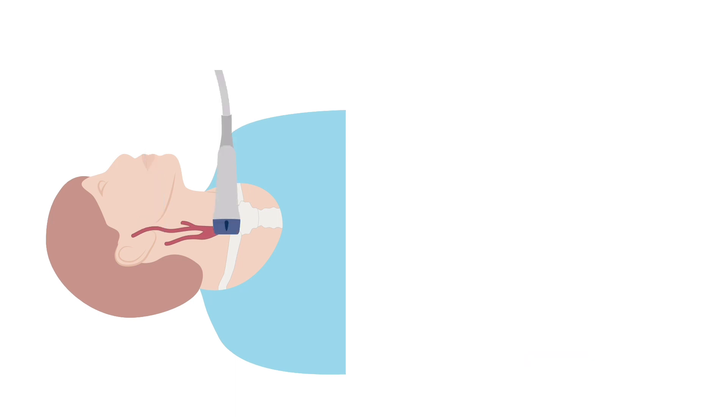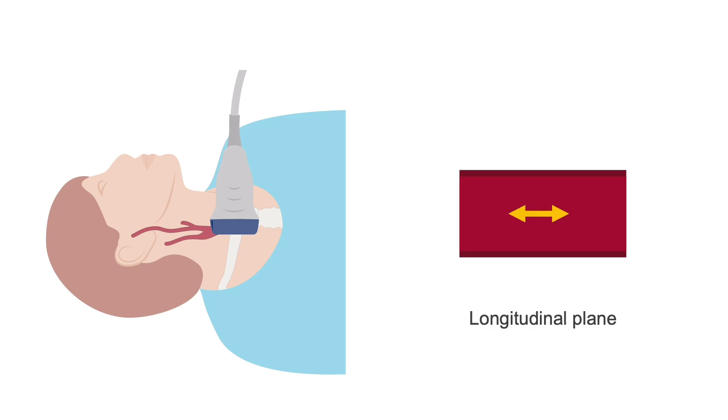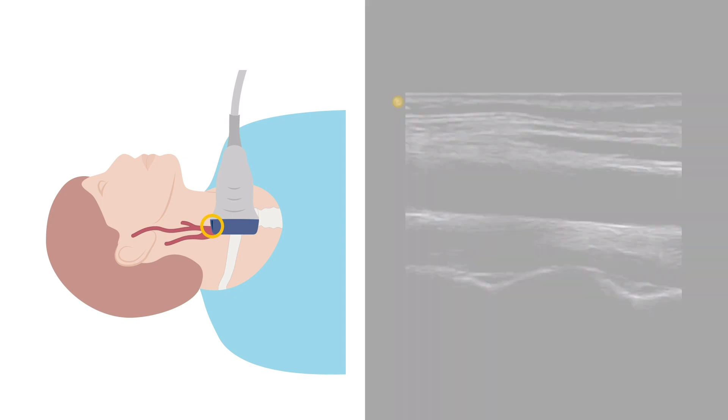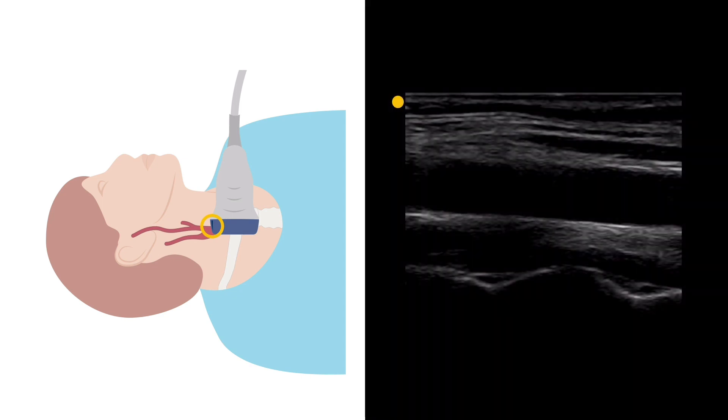Next, move back to the base of the neck and rotate the probe to image the proximal common carotid artery in the longitudinal plane. The orientation marker should be pointing towards the patient's head. Here the marker at the top left of the image will indicate the head end of the patient.